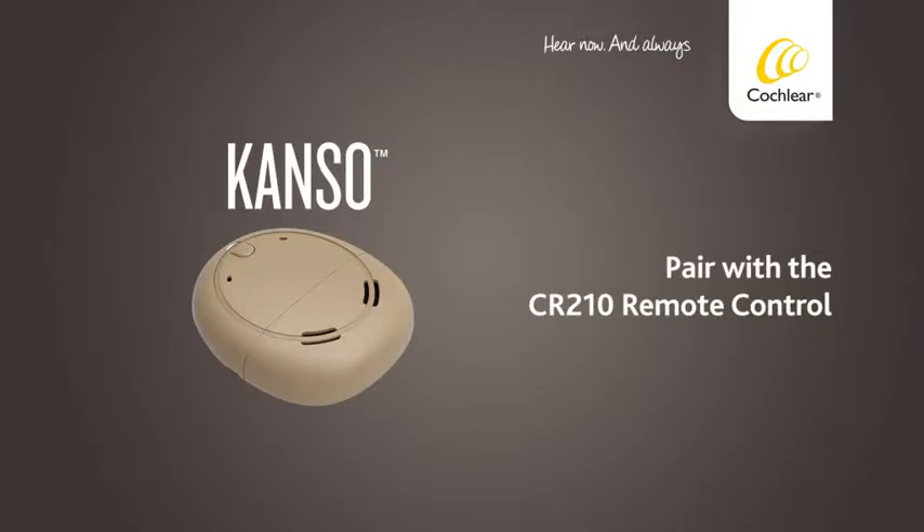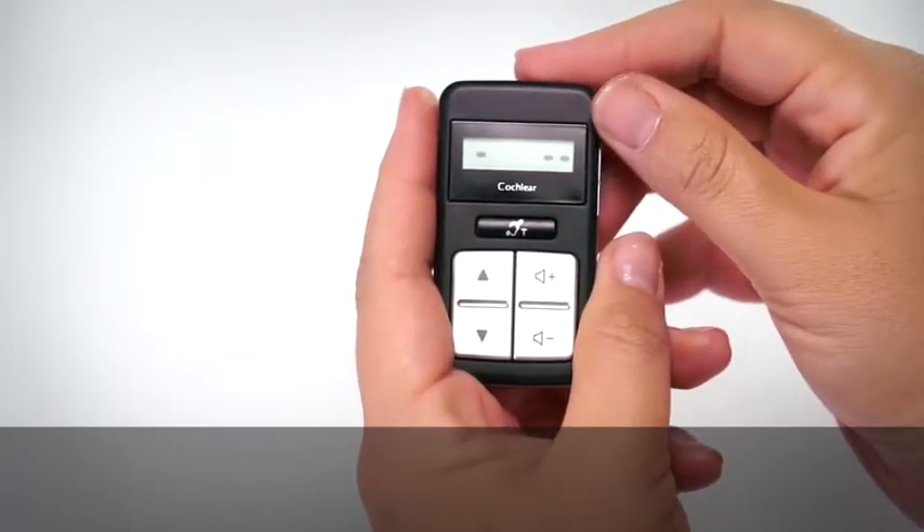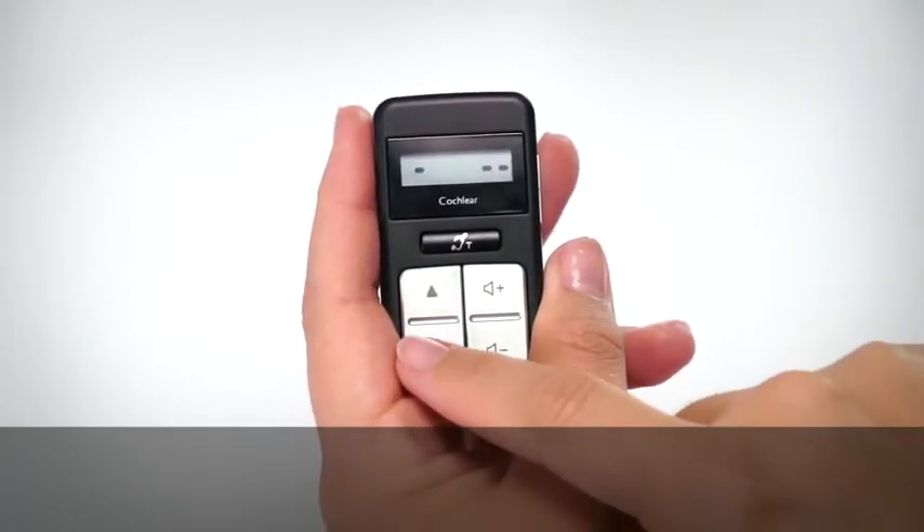Pair with the CR210 remote control. Pairing allows two devices to communicate with each other. Your clinician may have already paired your remote control with your Kanso. If not, you'll need to pair it the first time you use it.